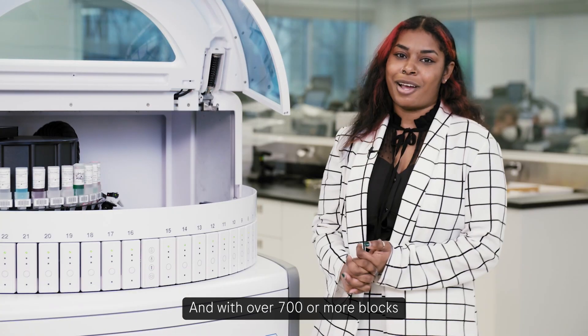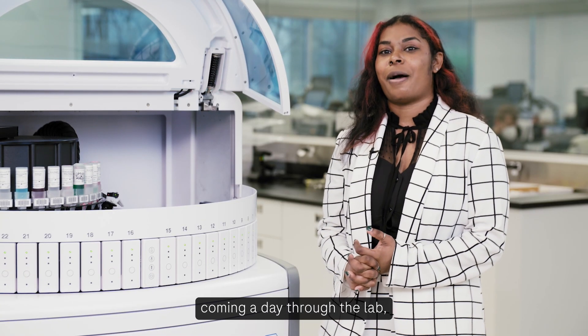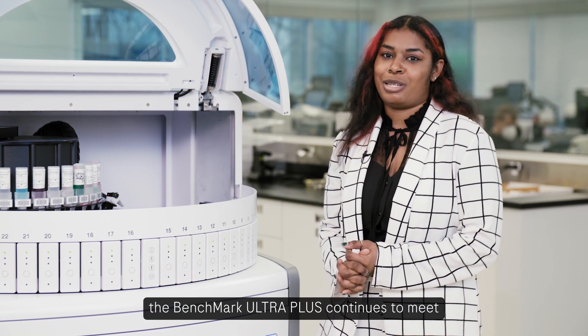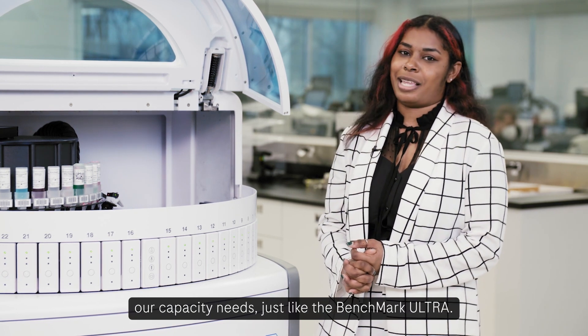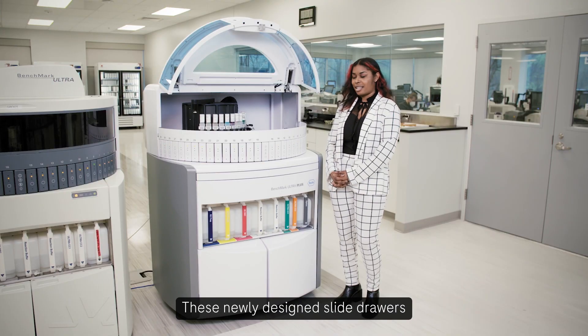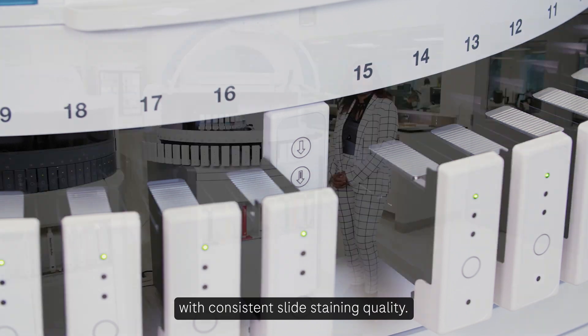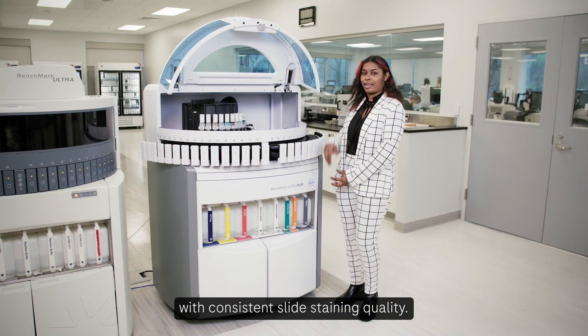With over 700 or more blocks coming through the lab each day, the Benchmark Ultra Plus continues to meet our capacity needs just like the Benchmark Ultra. These newly designed slide drawers also mitigate fluid leaks for better reliability with consistent slide staining quality.